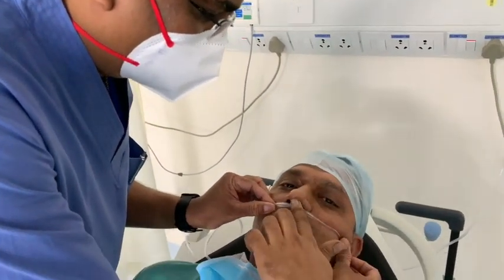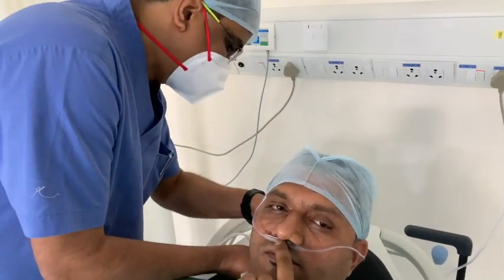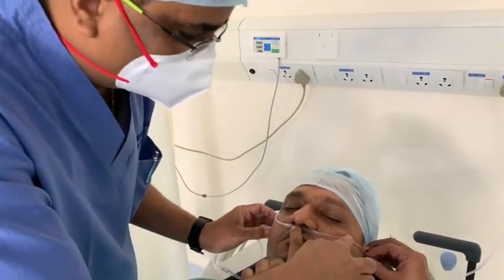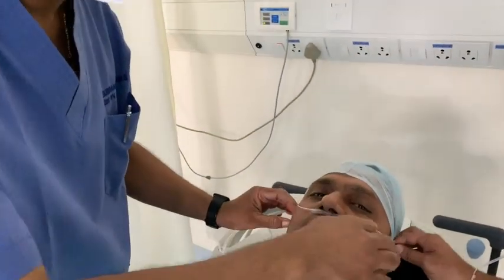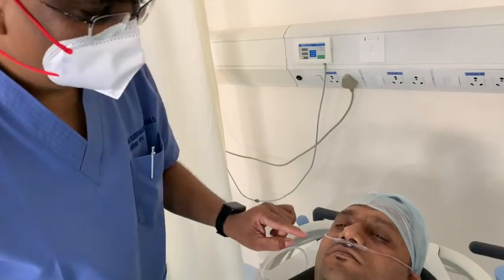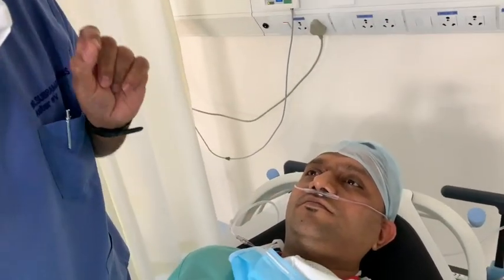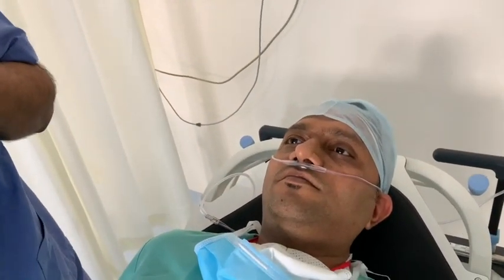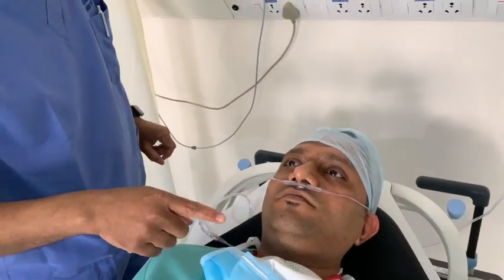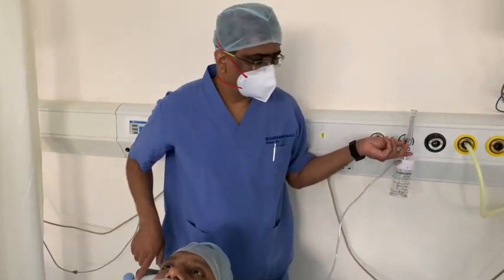Once it is in place, you can gently tighten it at the back. Now you can see this is tightly fixed to the face. You can use a small plaster to keep it in place if you want. Both nasal prongs are now in the nose and oxygen can be given through it.